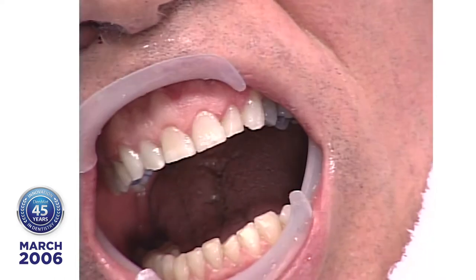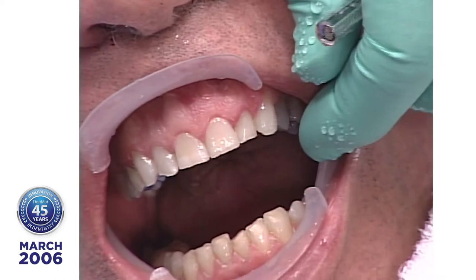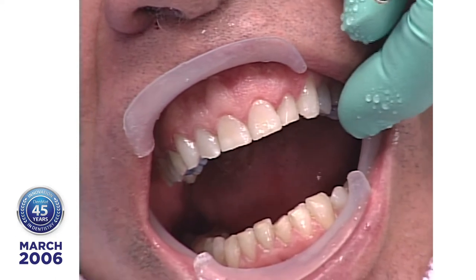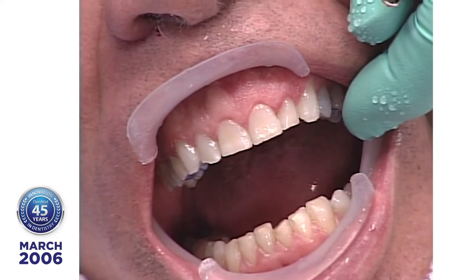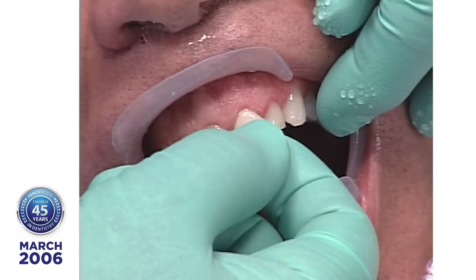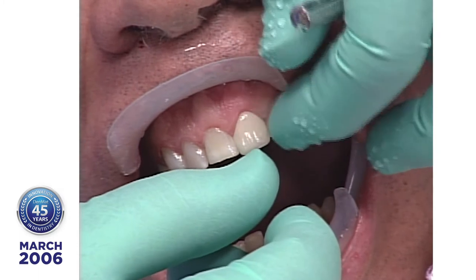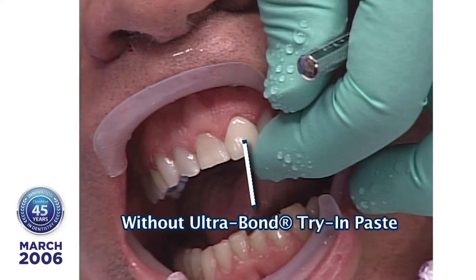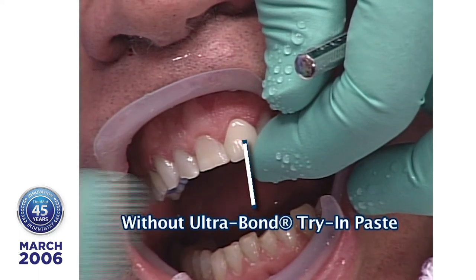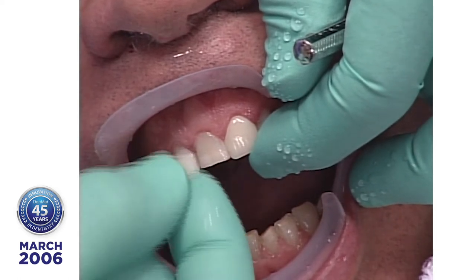Okay, now what we're going to do with the patient is do shade selection. Normally, I don't like to put all of the Lumineers in and let the patient look at them because they never look very good, and there's always something wrong. I'm putting the left central on without any try-in paste. So that's the shade of it without anything underneath it. What you're getting back is reflection of the etched surface.